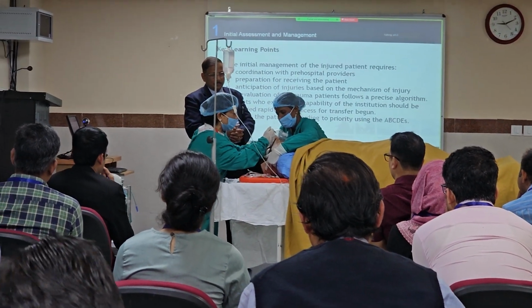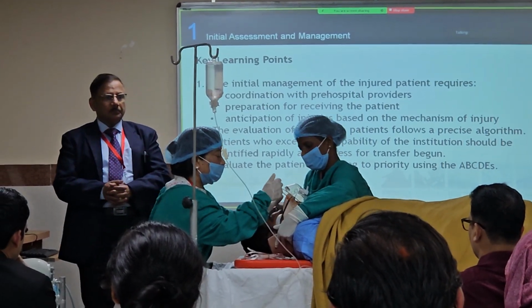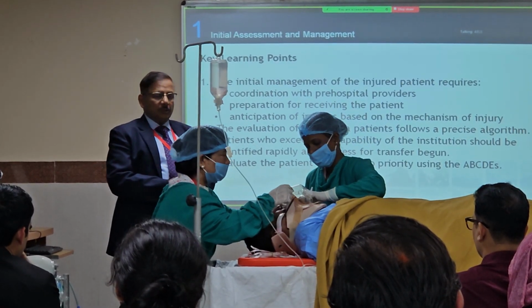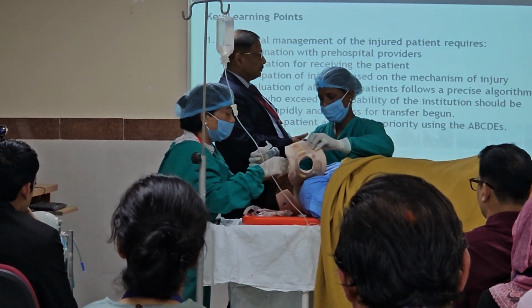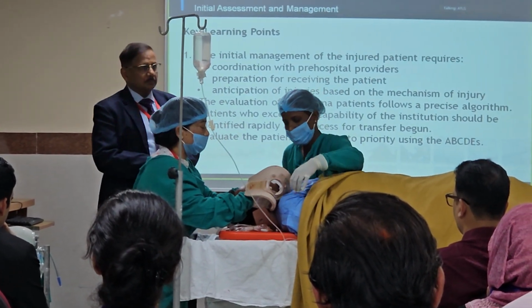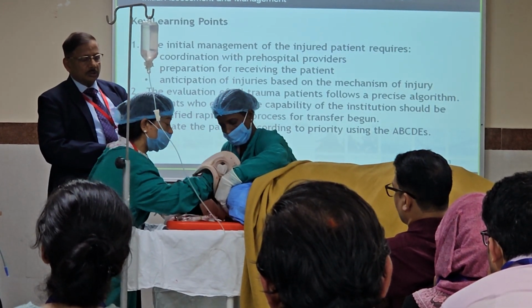I'm going. Can I see the vocal cords? Sir, you are not able to see the vocal cords because of the secretions. Oh. Patient is having 70% now. Okay. Right. Can you stabilize this now? Okay. Right. Now, sir, can I see the vocal cords?